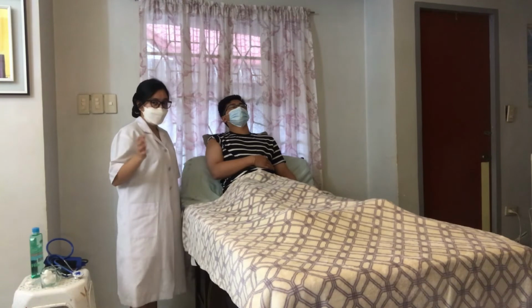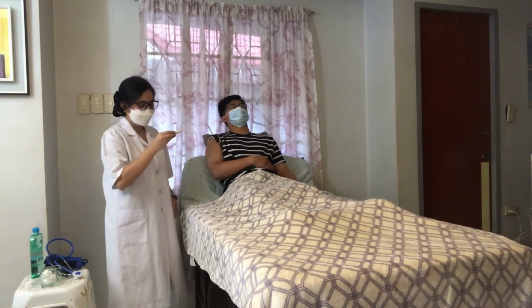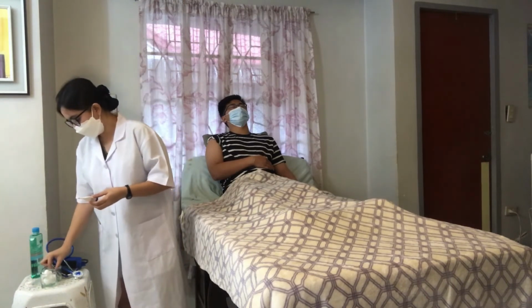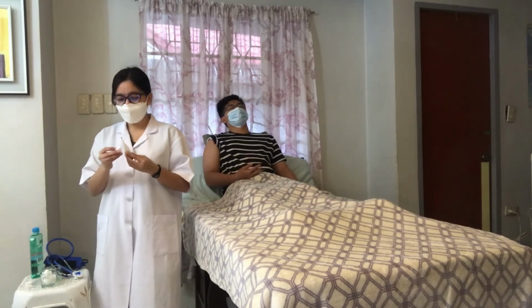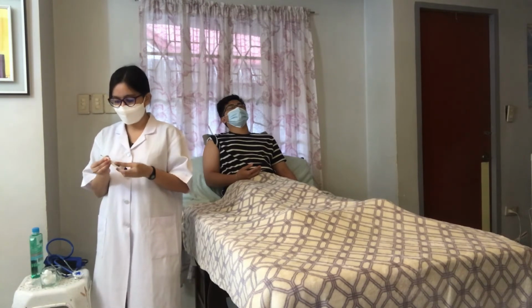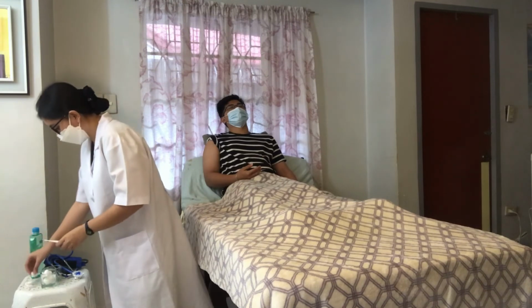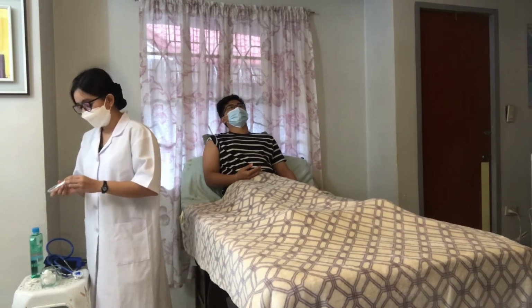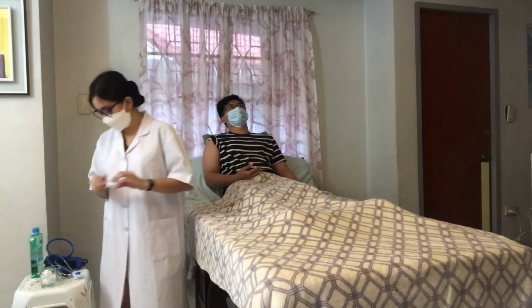Before that, we are going to remove the thermometer and disinfect it. But this time, in disinfecting the thermometer, we are going to start from the neck or the base up to the sensor. And then place it again in the container so that the thermometer is ready for the next patient who will use it.